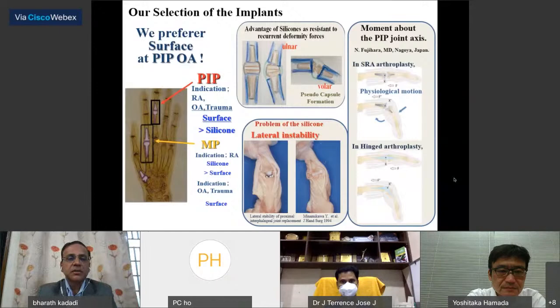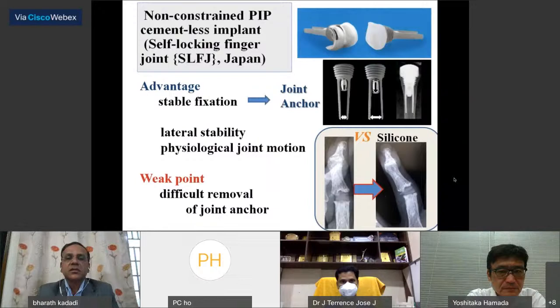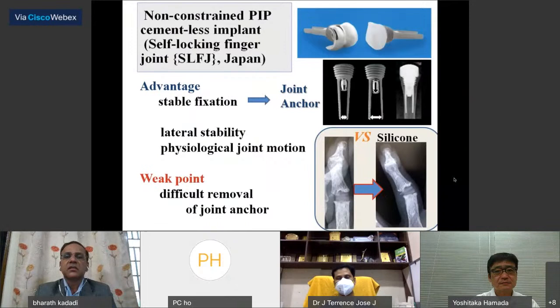Our senior author developed a non-constraint PIP cementless implant, SLFJ. The advantage is that the joint anchor is stable for a long time, with physiological motion and stability against lateral stress. As a weak point, removal of the joint anchor is difficult.